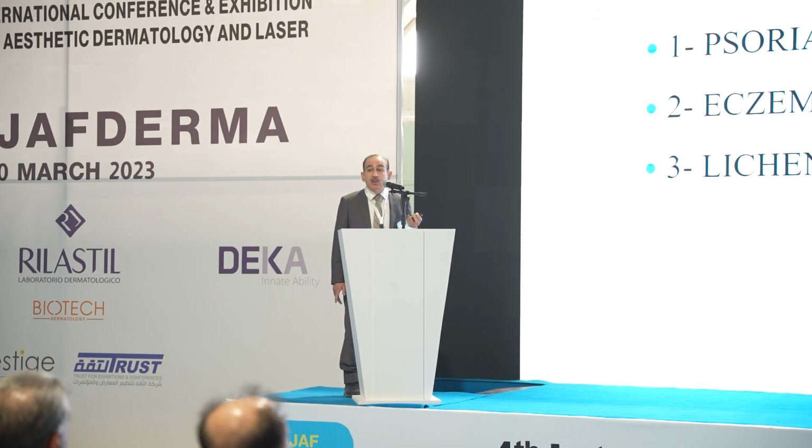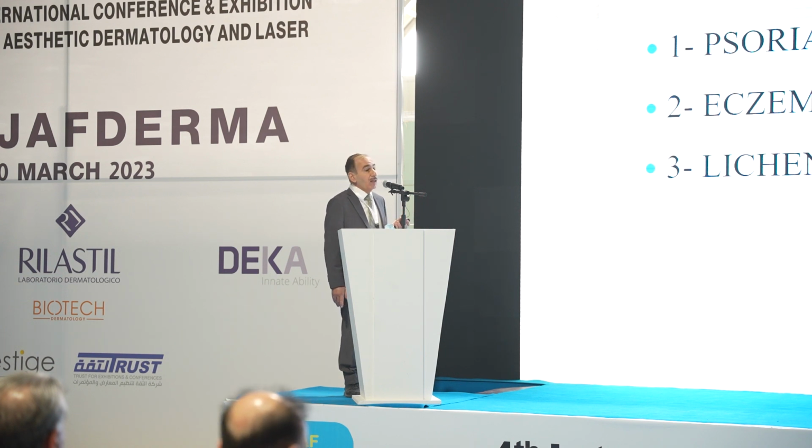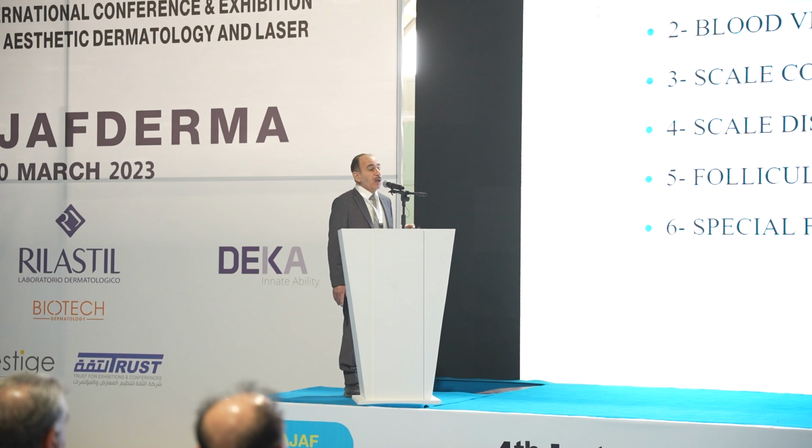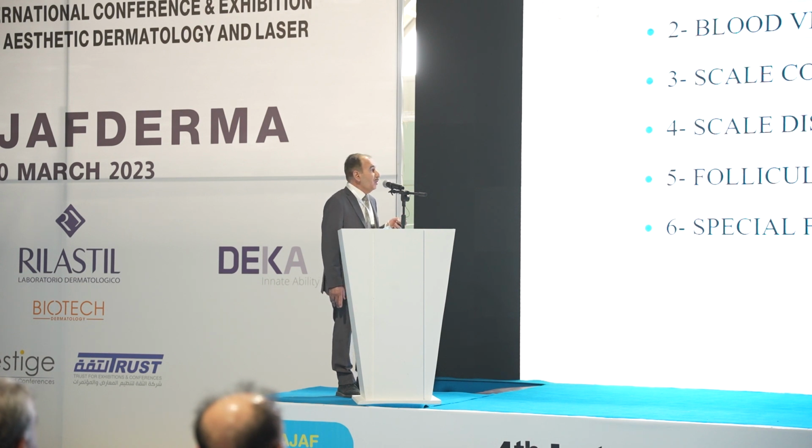So, without dermoscopy, if you are not sure about the diagnosis, you may go directly into a biopsy. But with the presence of dermoscopy, we can, in many cases, reach the diagnosis of psoriasis, eczema, or lichen planus in certain unusual cases without biopsy. What are the things that we are going to look at that help us in the diagnosis of these three diseases and differentiating between them? Of course, you can imagine what lies below the stratum corneum and below the epidermis.